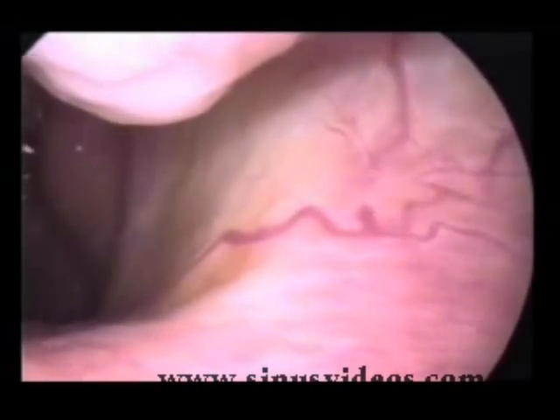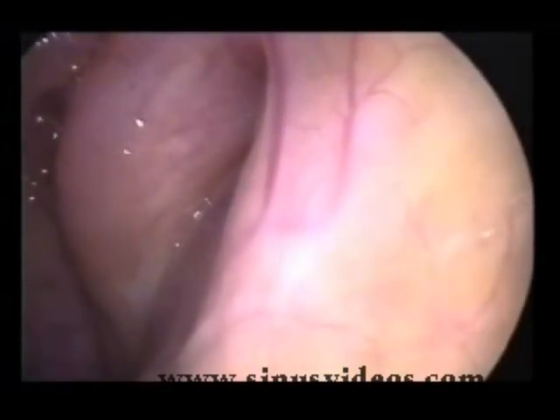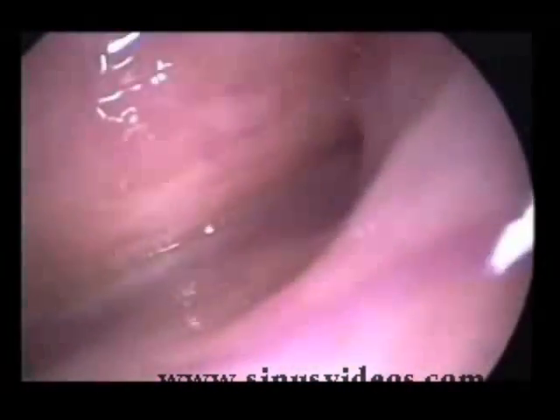This video demonstrates endoscopic images of normal and dysfunctional eustachian tube orifices. A 4mm 30-degree endoscope is being passed through the left nostril to visualize the nasopharyngeal orifice of a normal eustachian tube.